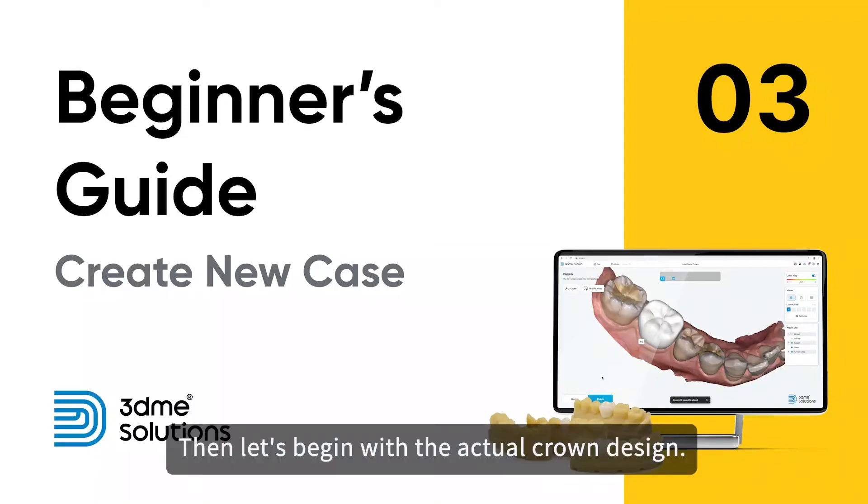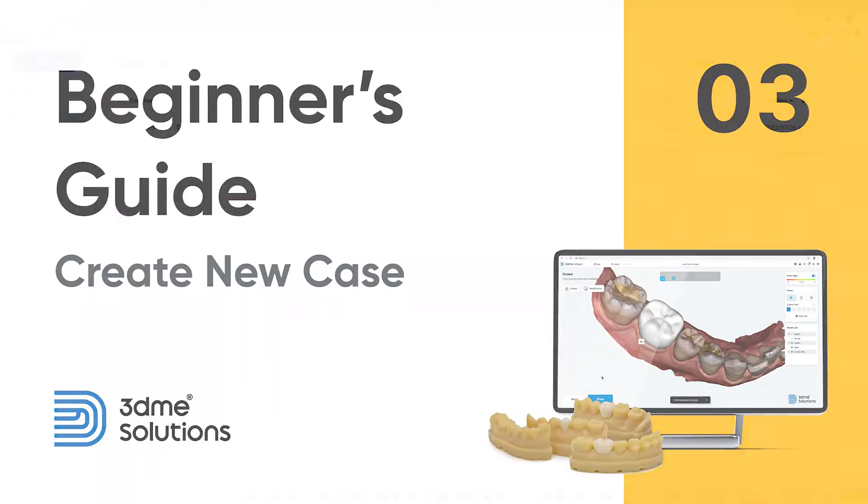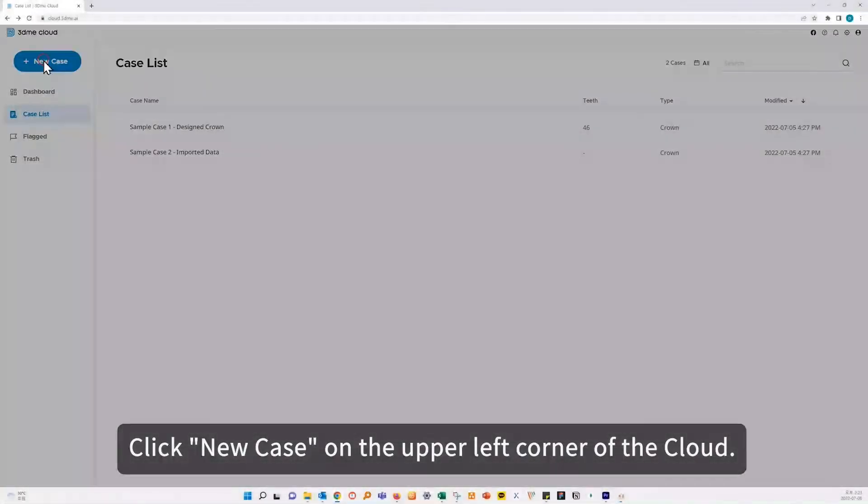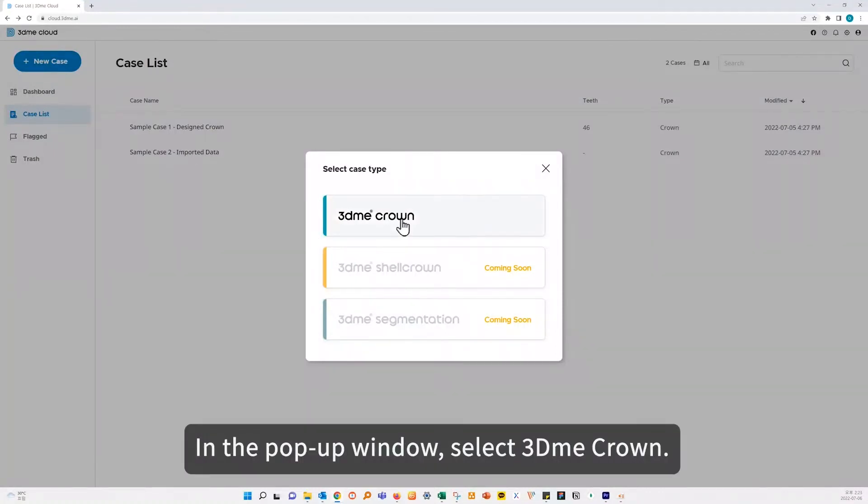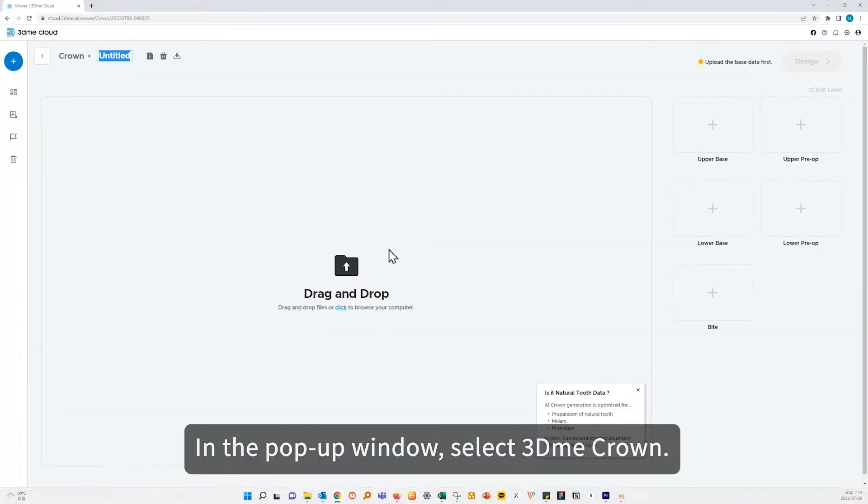Then let's begin with the actual crown design. Click new case on the upper right corner of the cloud. In the pop-up window, select 3Dme Crown.